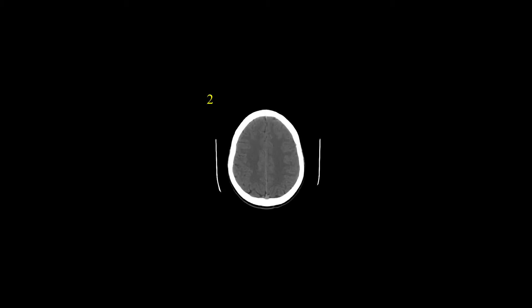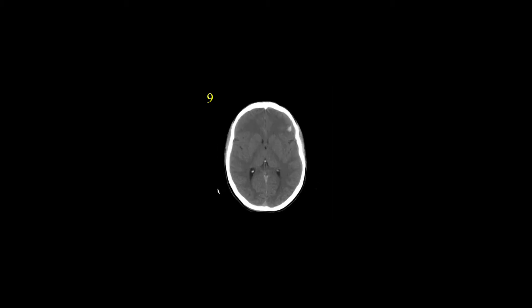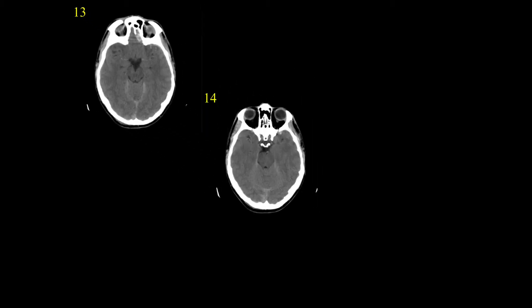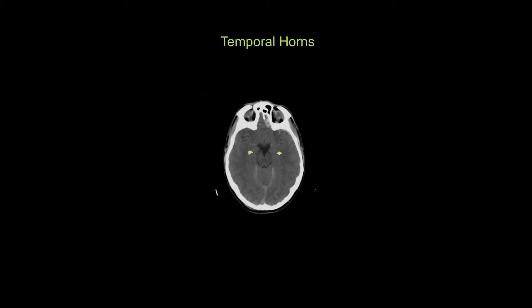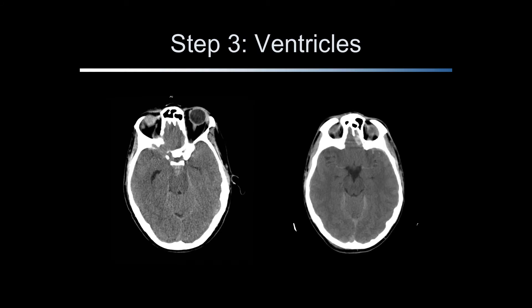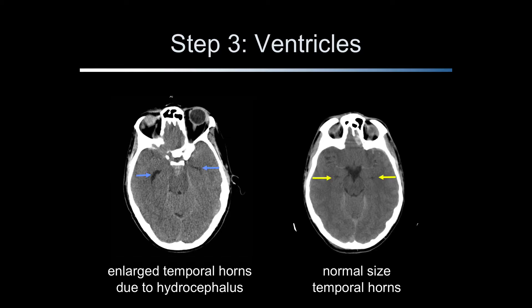As you continue to scroll inferiorly, the temporal horns, or temporal tips, of the lateral ventricles are seen at or near the level of the quadrigeminal cistern. These are typically L-shaped structures and may not be seen, especially in older generation scanners. The temporal horns are sensitive for the detection of hydrocephalus. If they are prominent, consider hydrocephalus as a diagnosis. The temporal horns indicated by the yellow arrows on the right CT are normal in size, while the temporal horns indicated by the blue arrows on the left CT are enlarged from developing hydrocephalus.